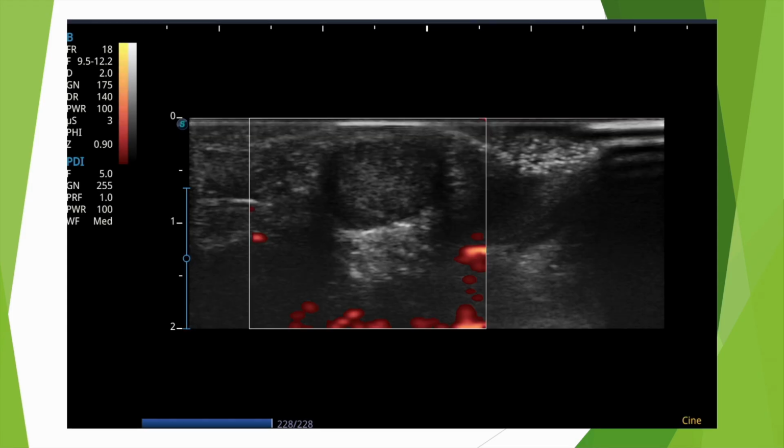The second criterion, which is very, very important, could actually overlap with the example I just gave you. In the patient's kidney, the fluid never shows up on Doppler, so you need to learn how to use Doppler. Here, we're using power Doppler. You need to learn how to adjust your Doppler settings to create artifacts. Here, it's not really flow, it's artifact, because when your Doppler setting reaches the artifact, you don't see any flow, and that's what I wanted to get at, absence of flow on Doppler.